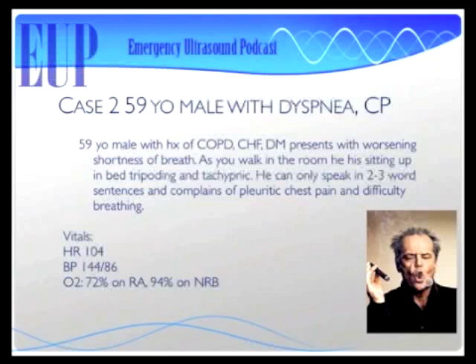Now, when you compare that to patients who did not have B lines, he found the BNP averaged 530, ranging from 300 to 1,900. So there were some patients who had an elevated BNP without B lines. Now, is that inaccuracy of the ultrasound or inaccuracy of the BNP?